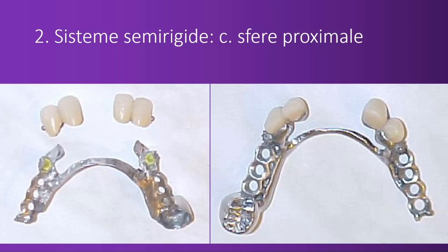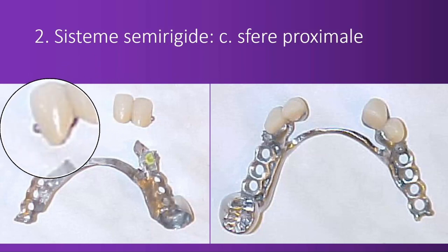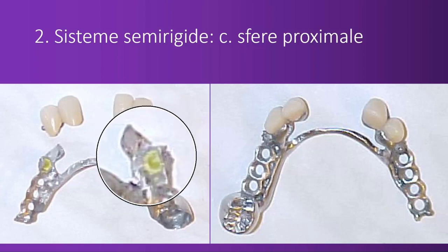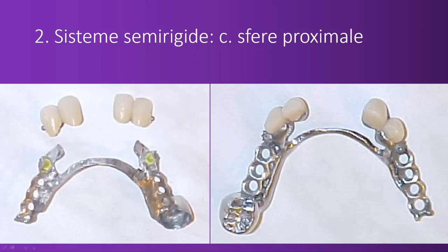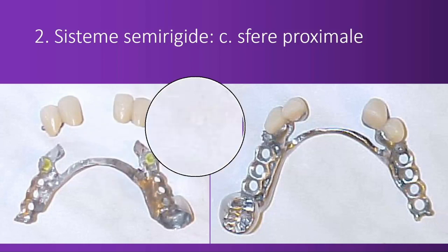Anyhow, so we have two metal ceramic crowns, united crowns, and on the distal is not a coulisse but a sphere, a ball attachment, and the retentive element is a device that goes click on that sphere, right? While the two are connected, there's also an arm.